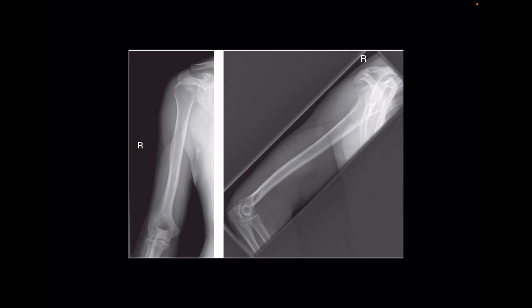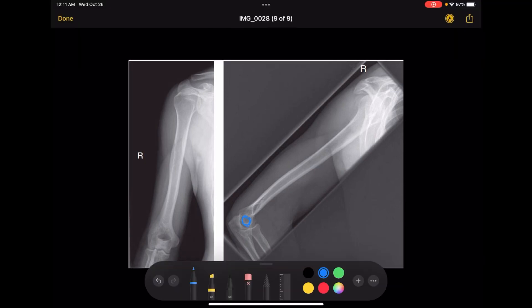The condyles of the humerus — the capitulum and the trochlea — when they are totally superimposed on each other, they'll look like a perfect little circle, and that's what you want in the picture. They need to be totally superimposed, which means they need to be perpendicular to the board. Thank you guys for watching.